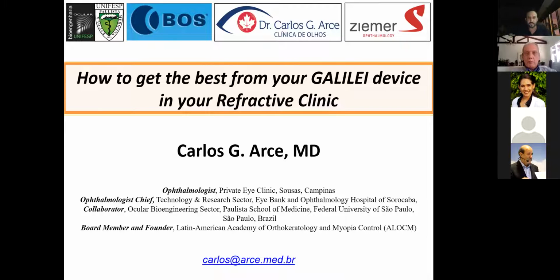So just a few words before starting. First of all, thank you everyone that joined this new refractive surgery basics webinar series that we start with the first episode on how to get the best of the Galilei device. This webinar and all the next episodes have as the main objective getting something very practical for a refractive surgeon, but also for people learning, residents and fellows in the field. And for that, we wanted to have the best speaker and the best expert in the field.